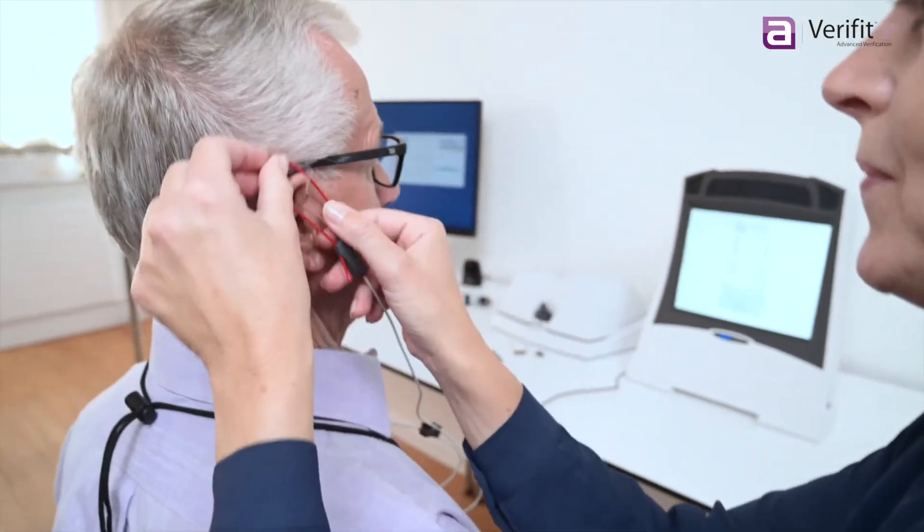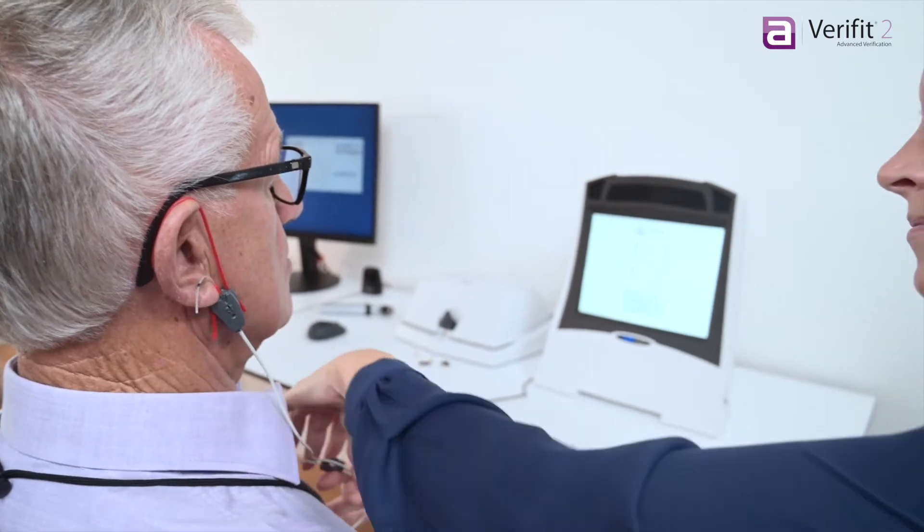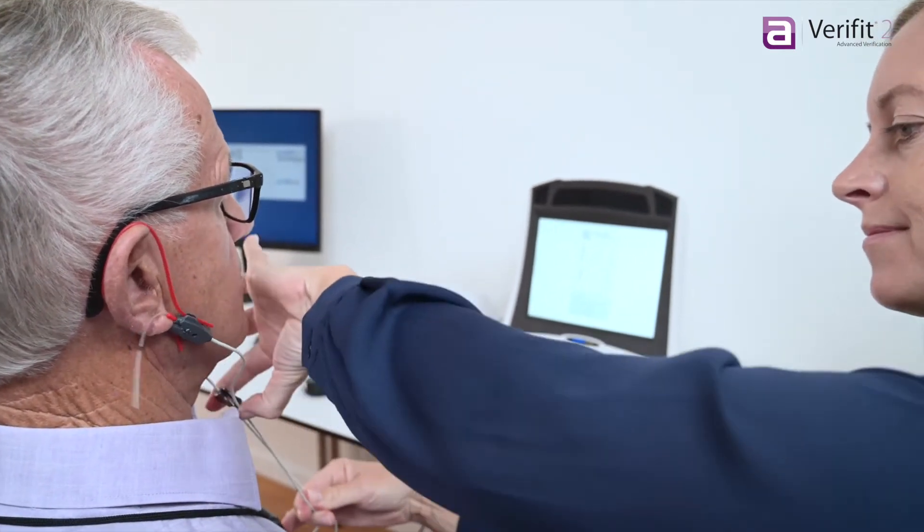Verifit2 is the most intuitive and advanced hearing instrument verification system in the world. Let's look at the features that make it unique.